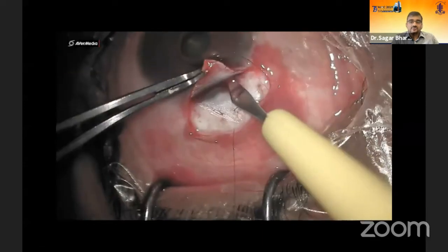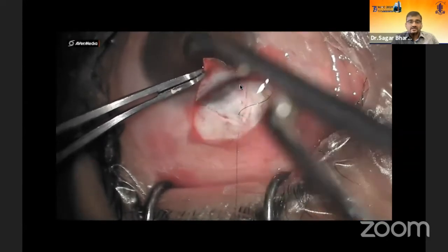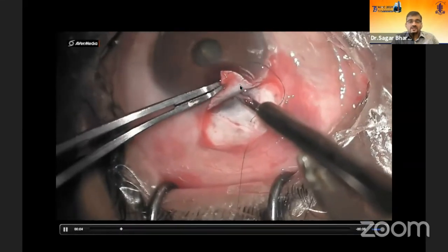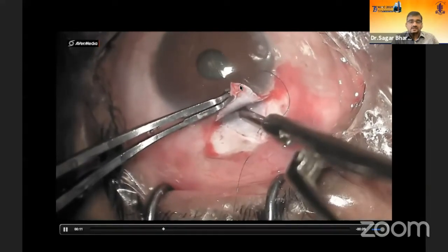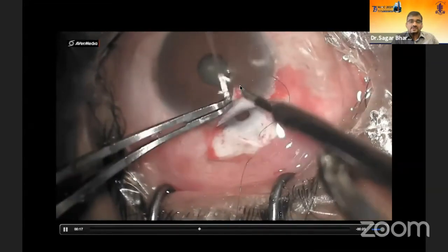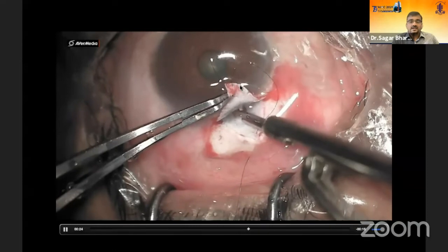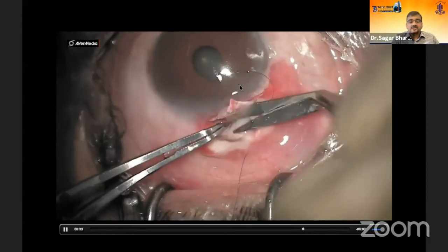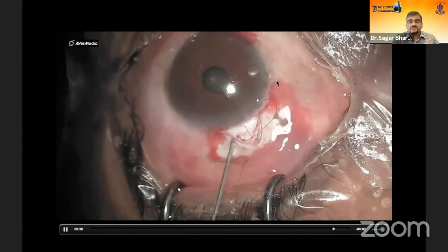For the sclerotomy, I prefer using a Kelly's punch. After entry, a 1.5-millimeter opening is sufficient. You then see the iris and pull it to do a peripheral iridectomy. Wash thoroughly to remove pigments and ensure the iris opening is patent. The side port entry done earlier is also useful post-surgery for deciding about flow from the flap by injecting BSS.